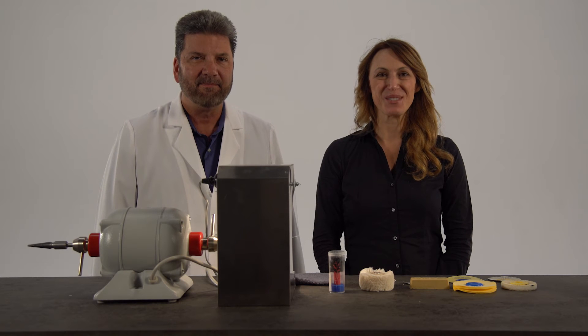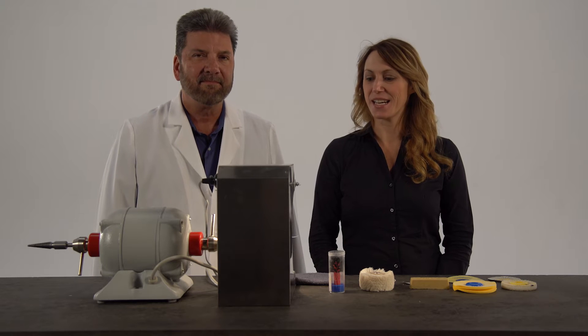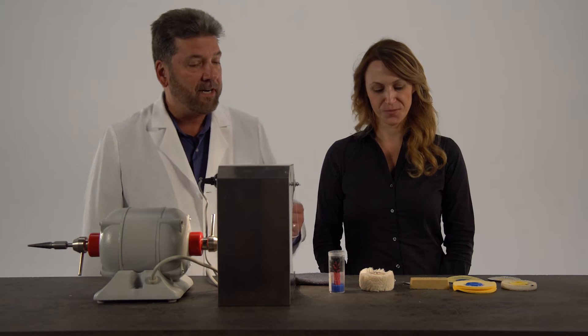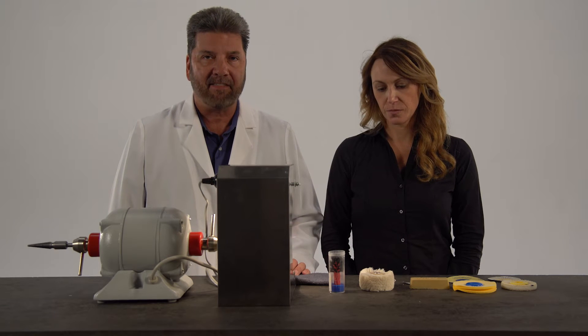Hello, my name is Tiffany and welcome to Keystone Industries. Today I'm here with Dennis Urban CDT and he's going to show us how to polish a Diamond D denture using Hatho from Keystone Industries. We're also going to show how we can cut our time in half by polishing using this three-step method with the Hatho polishing kit.